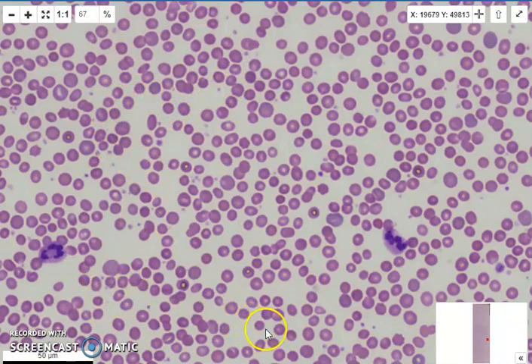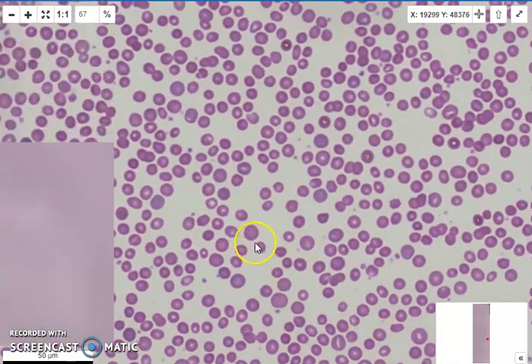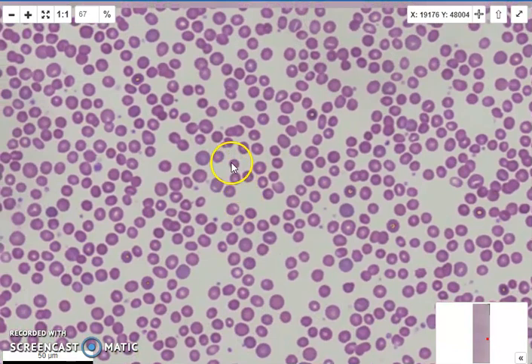And that might give the appearance that this is a dimorphic blood film and that there's two populations of cells. But what we really have are the smaller cells, which are the spherocytes, and the larger cells are our polychromatic reticulocytes. And that's what's giving that appearance of that dimorphic population. So sometimes you'll see that as well, and you'll think, oh, maybe there's some spherocytes here. So you see here, perfectly round and lacks central pallor. They're our spherocytes.